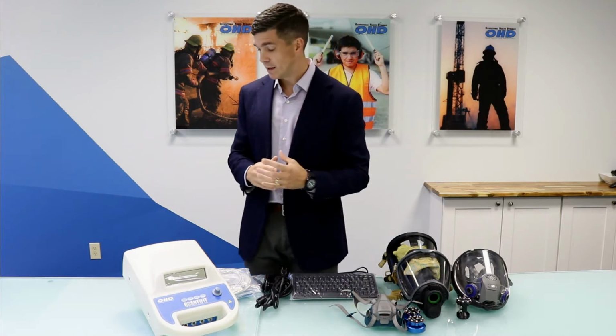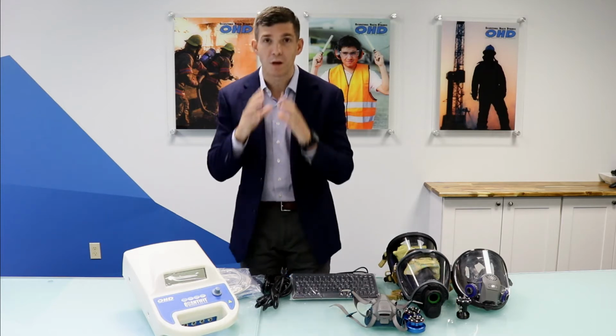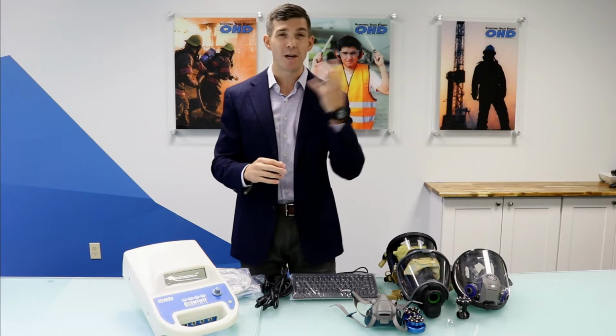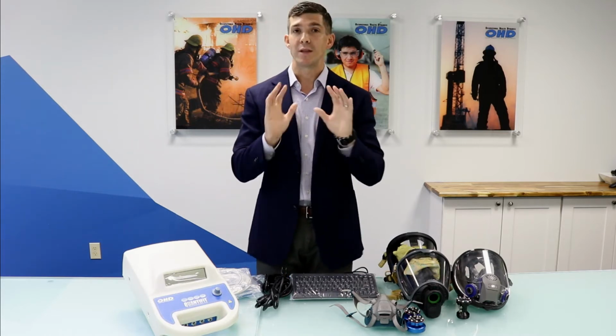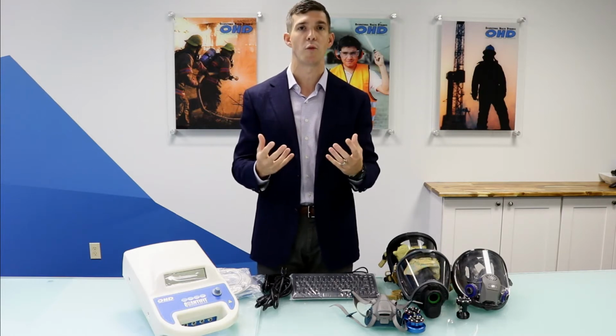Step 2 is that person is going to bend at the waist, really parallel to the floor. You're looking for gravity pull on the respirator there. Step 3 is a vigorous shaking of their head. So that's key too. It is not a slight, slow movement as you'll see in other protocols.